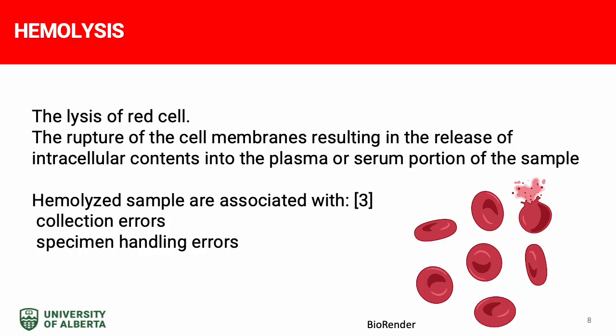Most instances of hemolyzed blood specimens are the result of in vitro hemolysis. In vitro hemolysis is caused by poor collection technique, mishandling of the specimen during transport, and specimen handling errors. Hemolysis has been recognized as the most frequent pre-analytical artifact encountered in laboratory specimens.